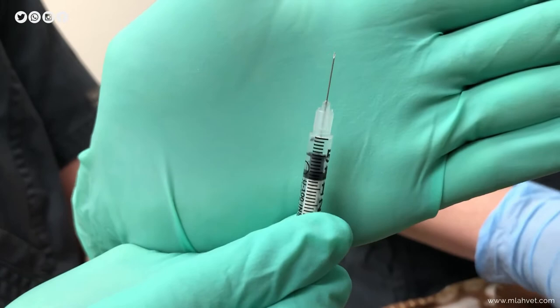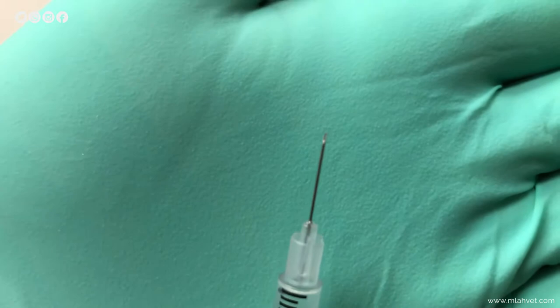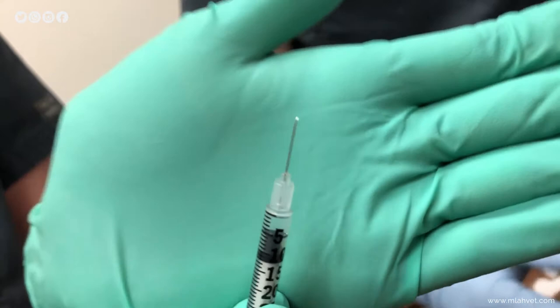The first thing you want to do when giving an injection to a reptile is look at your syringe and make sure that the bevel side is up. That's the little opening at the top of the needle — you just want to make sure that it's facing upwards when you give the injection.